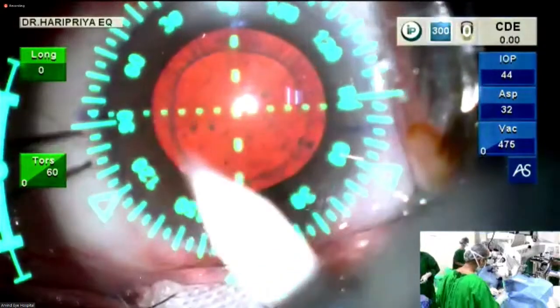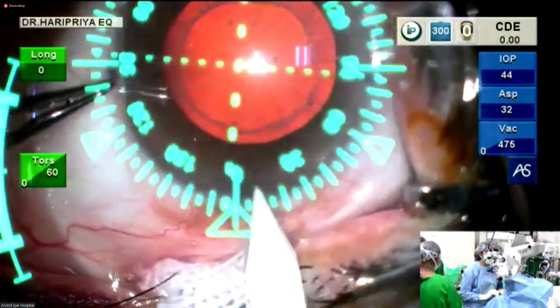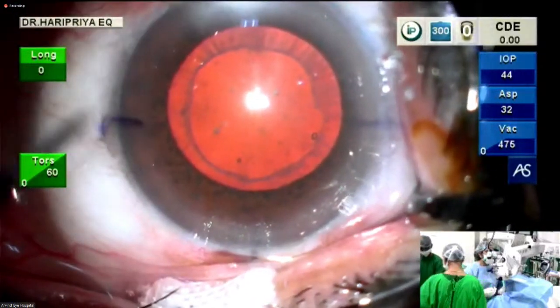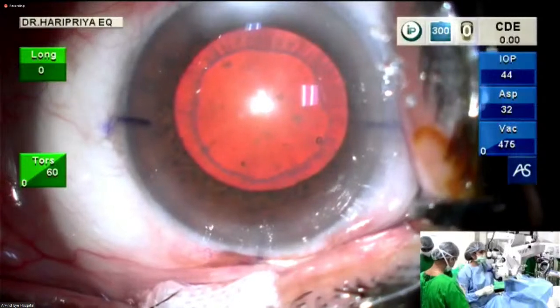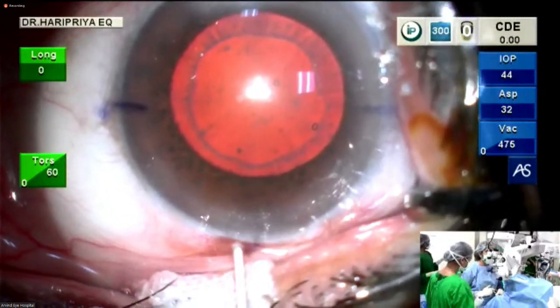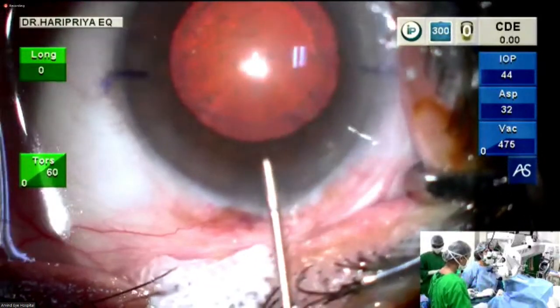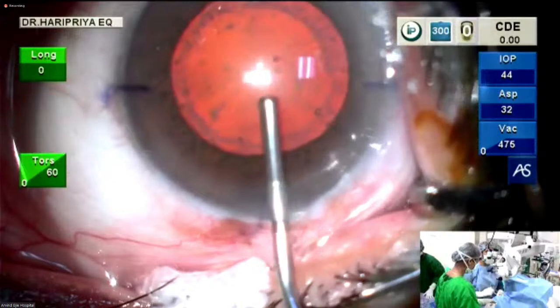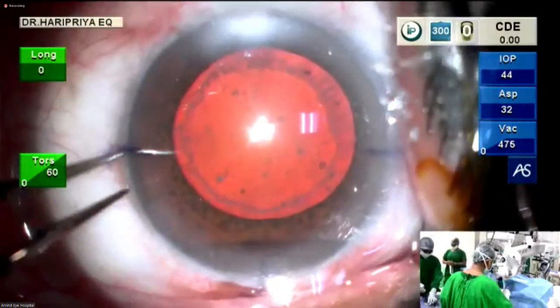The pseudoexfoliation is very beautifully seen on retroillumination. It couldn't have been better than this. Yeah, it actually appears like a true exfoliation. So I'm going to use Viscoat here. When I have a harder lens, and there is pseudoexfoliation, it can also increase the chance of corneal decompensation. Plus, with the hard lens, more endothelial damage is possible. So I'm going to be using Viscoat, which is a dispersive viscoelastic, and the chondroitin sulfate helps to coat the endothelium. It's a little modification of Steve Arshinoff's soft shell. I use a high-viscosity HPMC below the Viscoat and use that to form the anterior chamber and create the space.